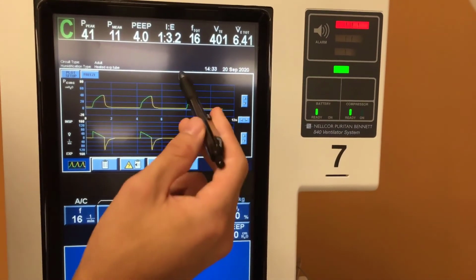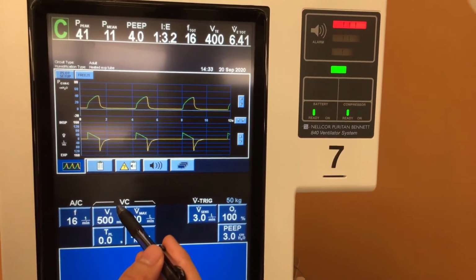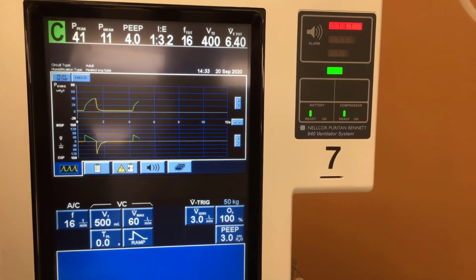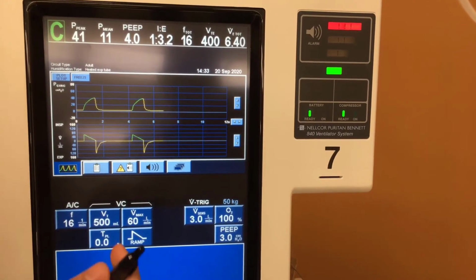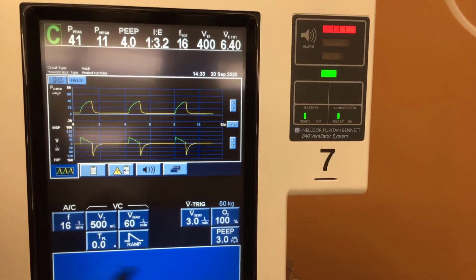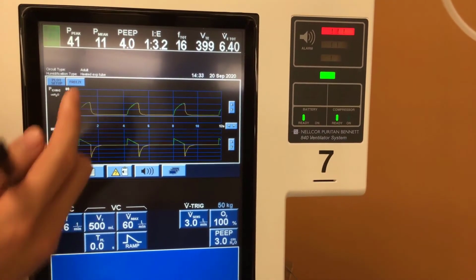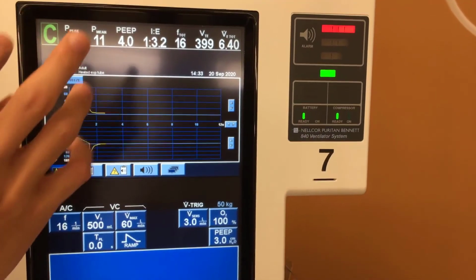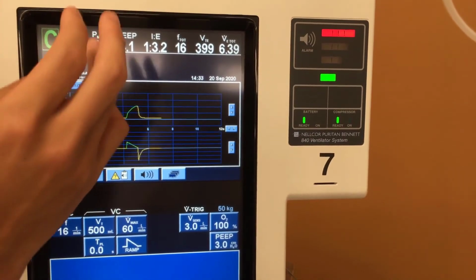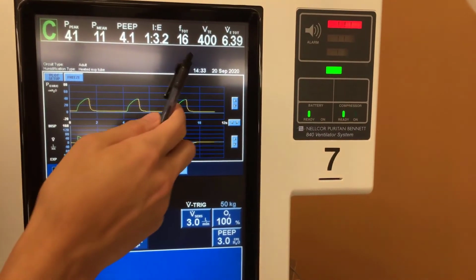So this 100 milliliter difference could be due to there being a hole or a tear in the balloon of the endotracheal tube set in. So that means about 100 milliliters of air is leaking on the sides of, or the ends of the trachea, past the torn balloon and escaping through the patient's mouth instead of the tube.